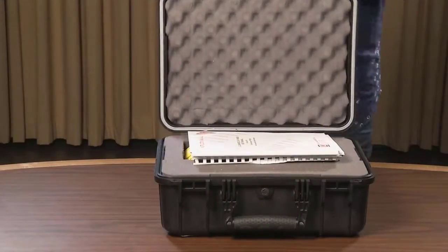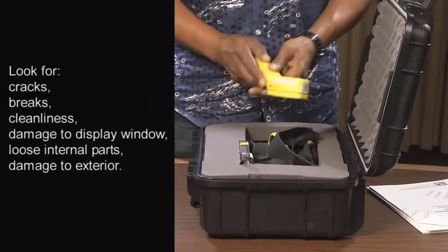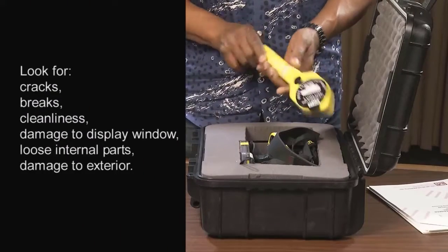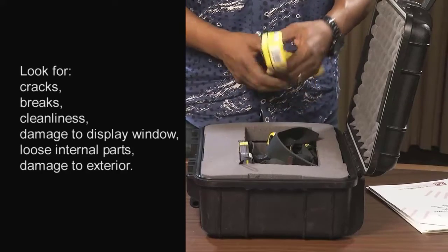Remove the meter from the case and inspect the instrument. Check for physical damage — look for cracks, breaks, cleanliness, damage to the display window or loose internal parts, and damage to the exterior of the detector.